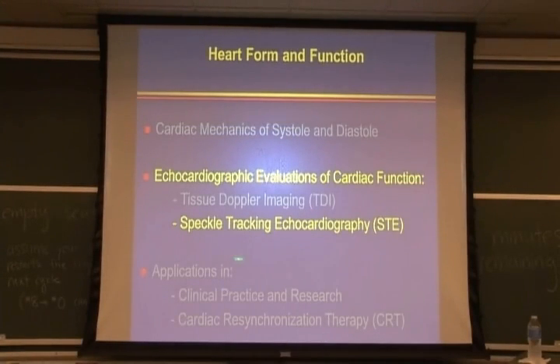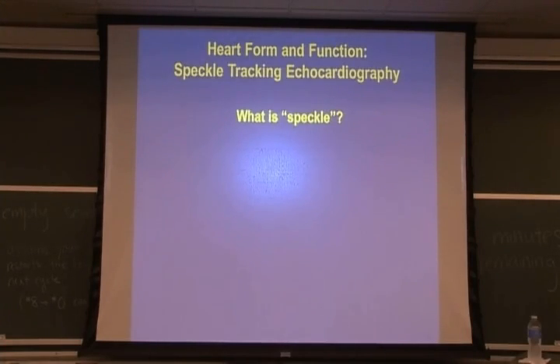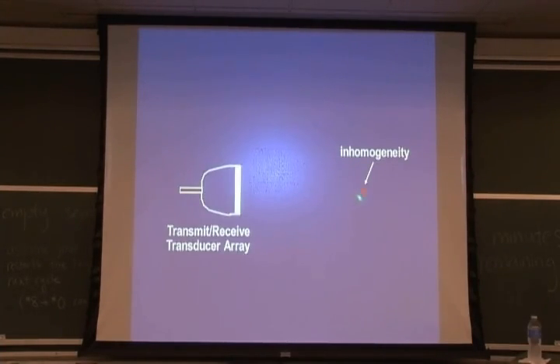So I'll move on now to speckle tracking, and how we can apply it in measuring myocardial deformation, myocardial strain and strain rate. The speckle is basically an inhomogeneity in any tissue. If you send a waveform through the transducer, it is reflected back. If you send another one, and there is more than one area of inhomogeneity, the other waveform comes and interferes with it.